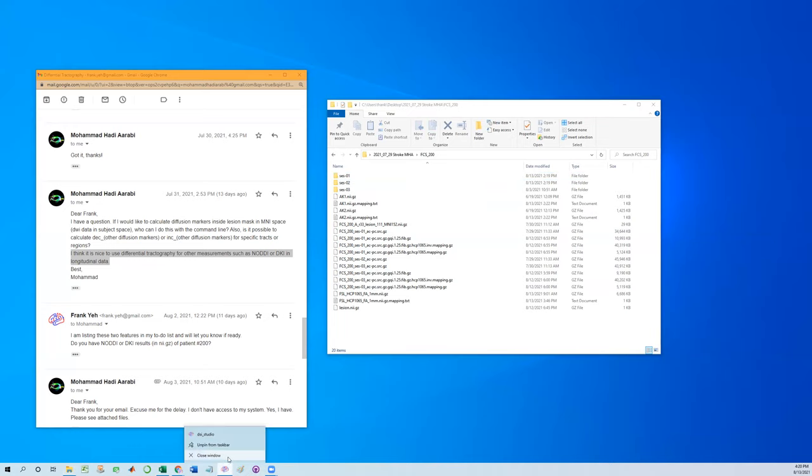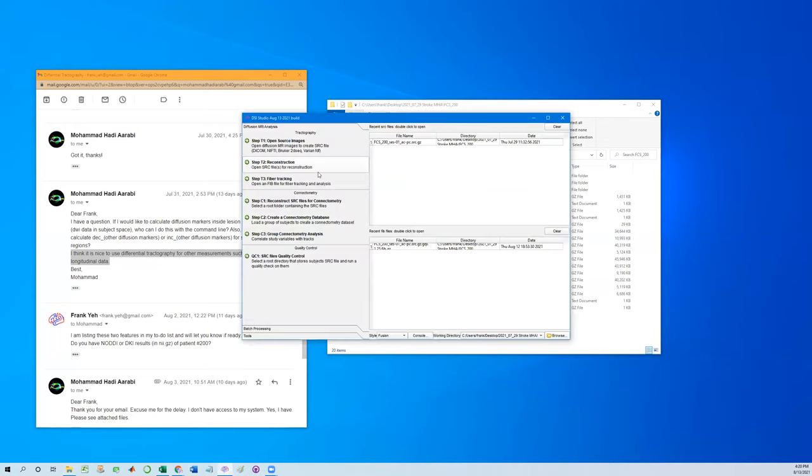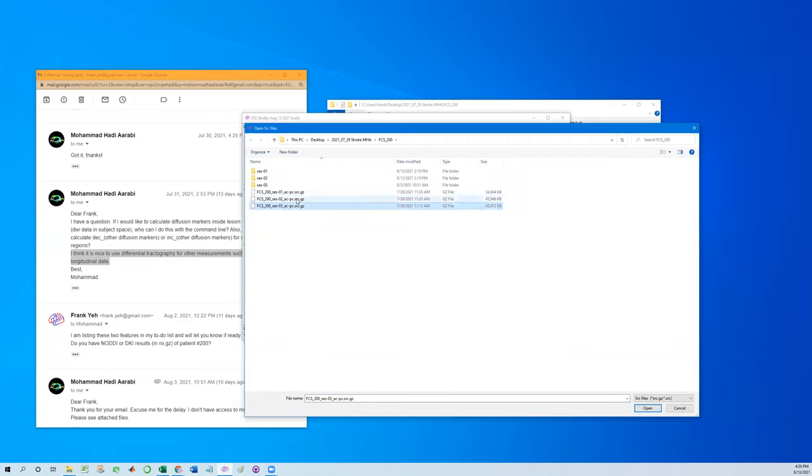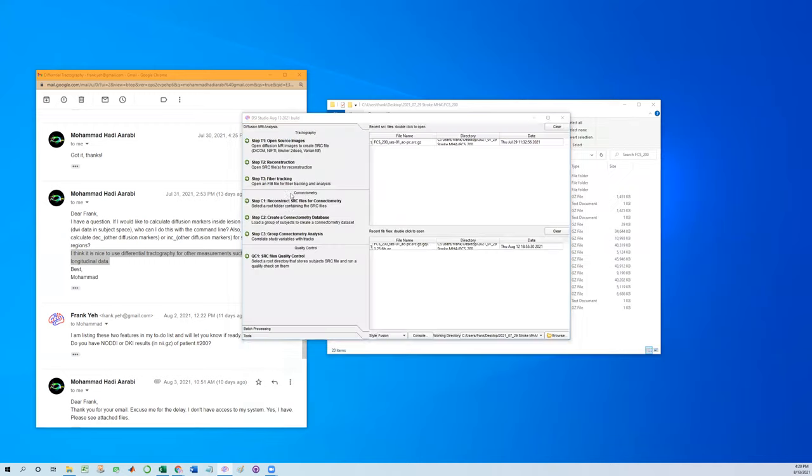So to start with, let's begin with the SRC file. Here, starting from step T2, from the SRC file, we will pick the baseline scan. And here it doesn't matter whether we use the second or third scan. The only purpose is to provide a framework for fiber tracking.